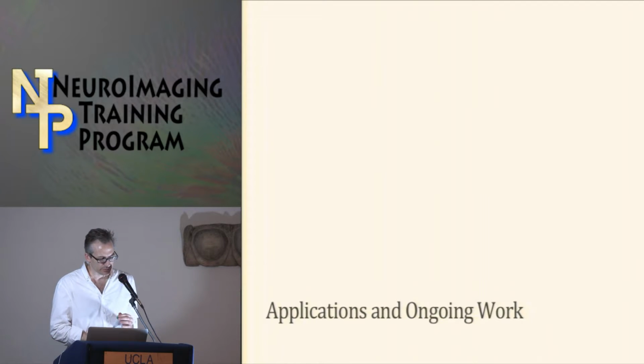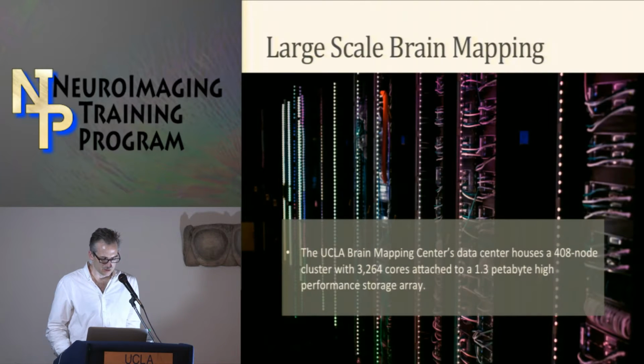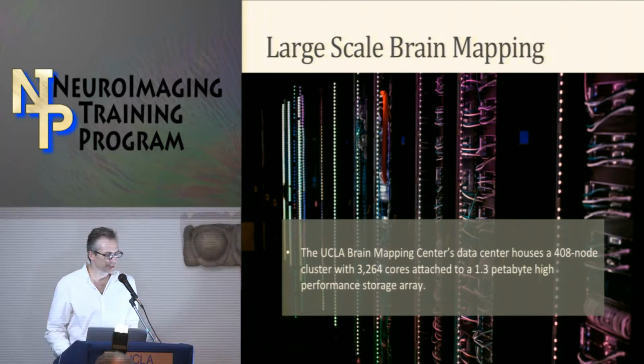All right, so that really captures what I wanted to say about the software so far in terms of the methodology. I did want to talk a little bit about what we're doing with it and how we're applying it and how we're trying to make it easier for people to use the software in larger studies. Obviously we're getting larger and larger data sets with hundreds or even thousands of subjects. Many of them are publicly available, so you'll soon be able to get the full 1,200 subjects from the Human Connectome Project, and there are thousands of subjects being collected for some of the follow-on Human Connectome studies.